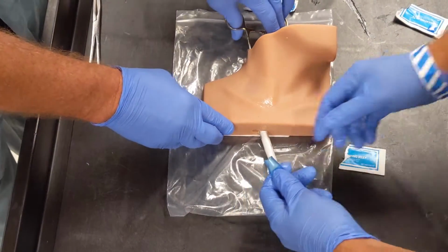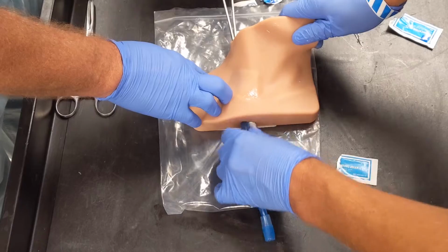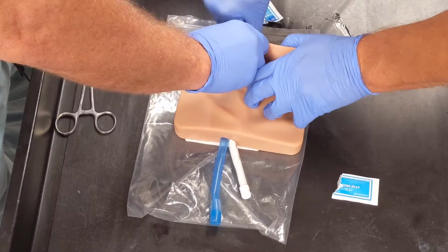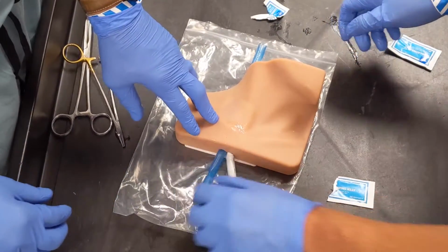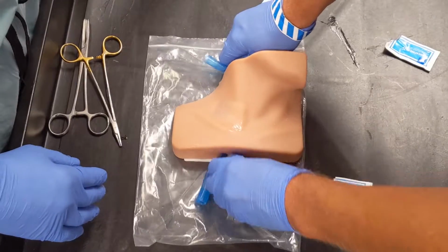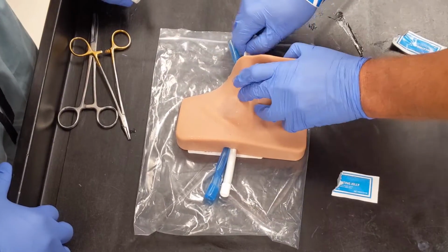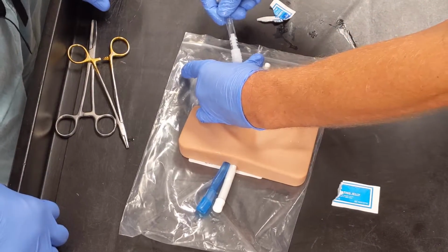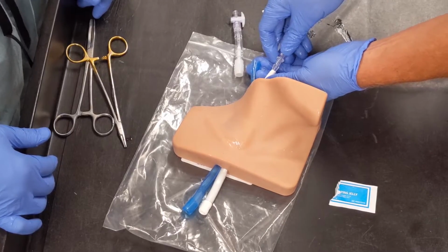Next, do the IJ. Open it up. Okay. Just grab at the end and pull it through. You don't need to go all the way. Leave some length to it, as we'll adjust it later. There's a sheath here over this vessel, and you just kind of push it into the neck. And then we're going to wipe off the excess lube, and we'll connect this connection to the internal jugular vein, and this one goes into the carotid.